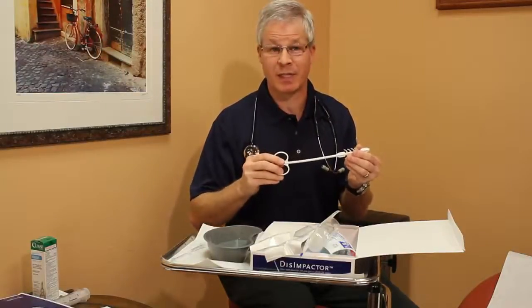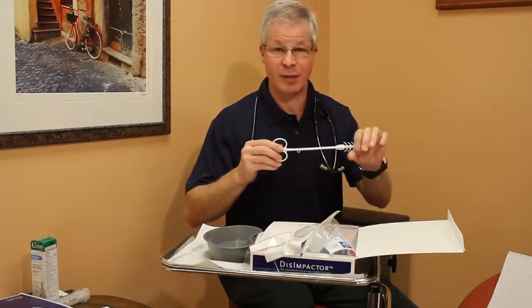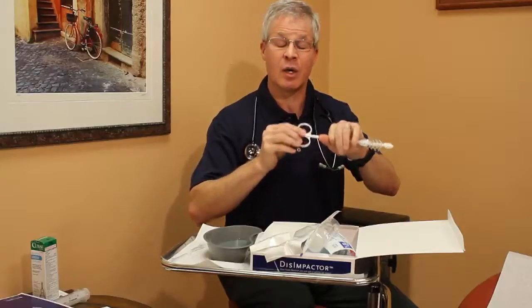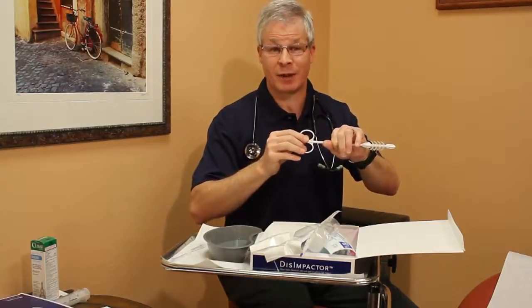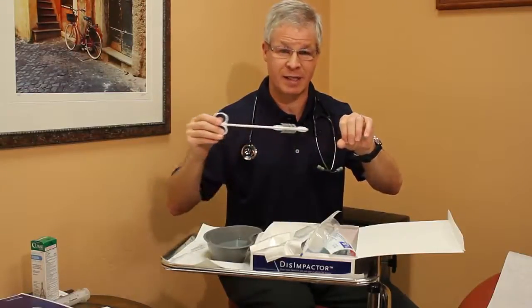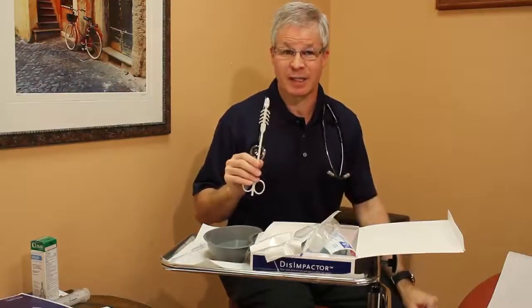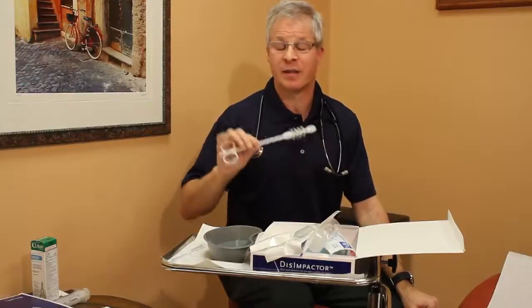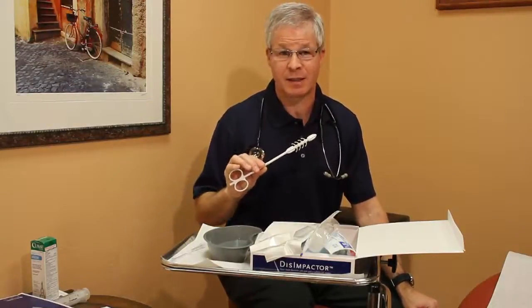That's provided because of different patient body habituses, but you'll certainly want to be able to feel that the device has completely engaged within the fecal mass. Once that occurs, we're now going to ask the patient to bear down as if they're having a bowel movement, and we will withdraw the entire device. Once the device is out, you'll need to inspect it, assure that it's intact, and then discard it right away in the biohazard bag. These are single-use, non-cleansable or sterilizable devices.